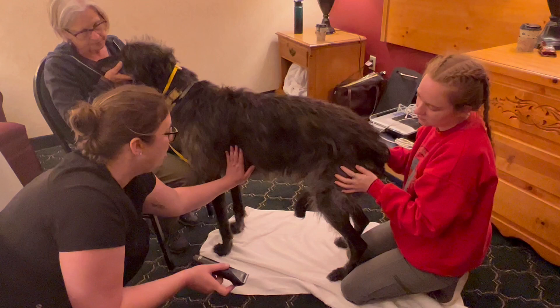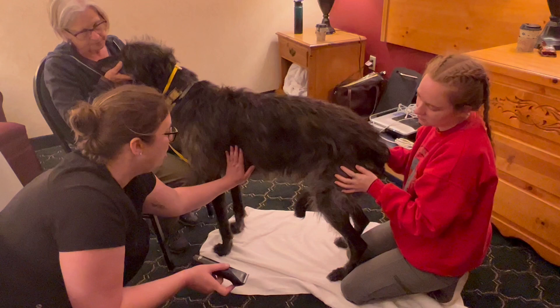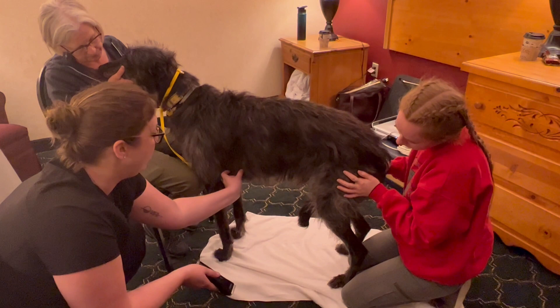We usually just do a little square. You can feel their heart — you can see their heart, they're so thin. We'll want one patch down here by the sternum, and then one patch a little bit higher, kind of right above the point of the elbow.